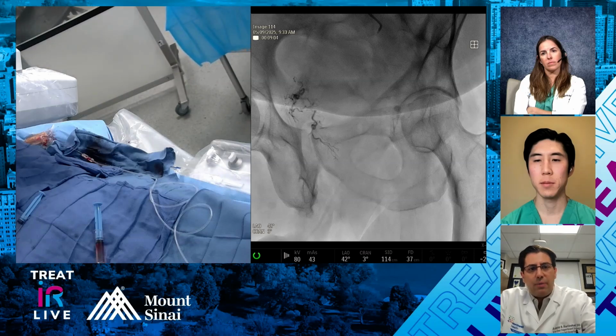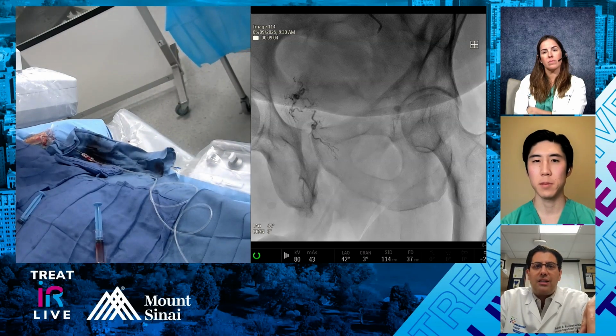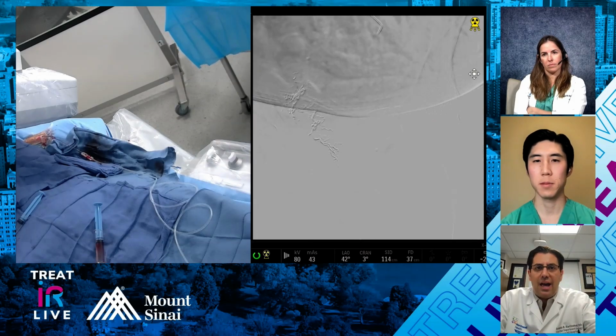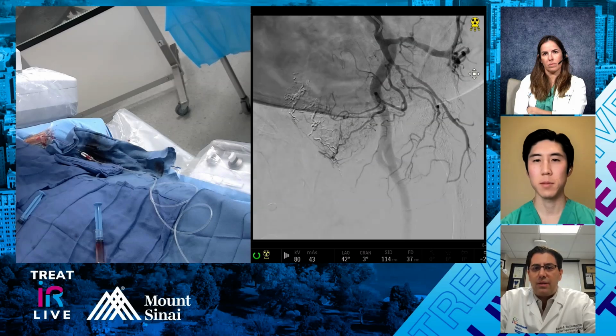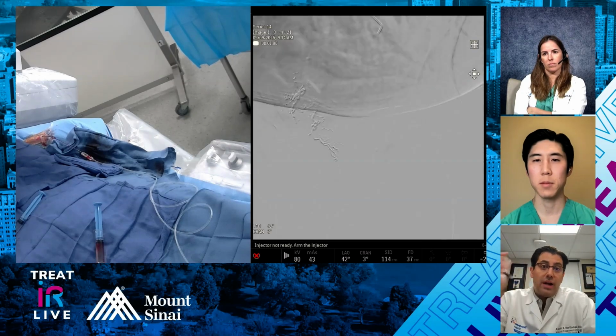I think also, I just want to make a point. Dr. Fischman is using a 40-degree ipsilateral. I typically do the same way every time, 30 over and 10 to the head, to make it easy, the same way every time. So that's just another comment that I wanted to make on the technique. But theoretically, if you know where you are, you can recognize all these things.